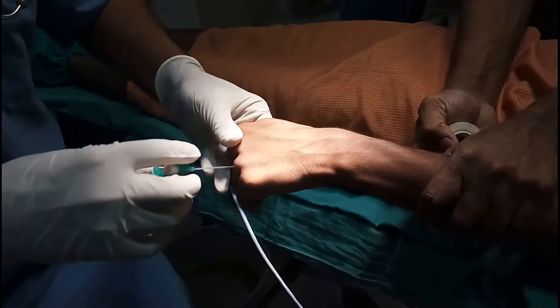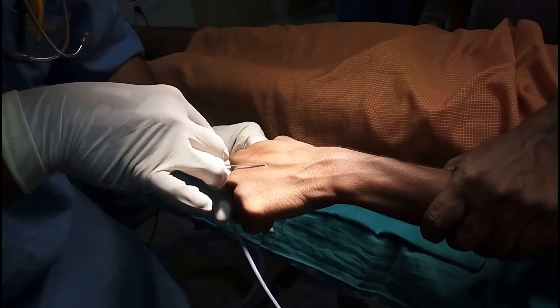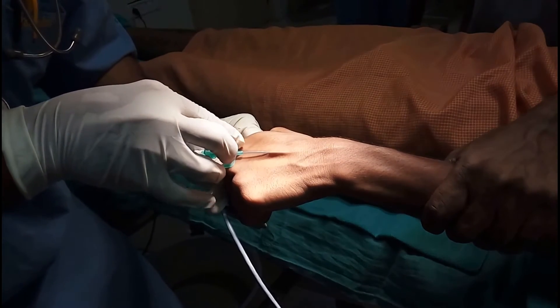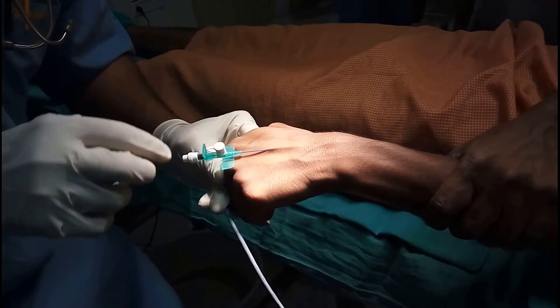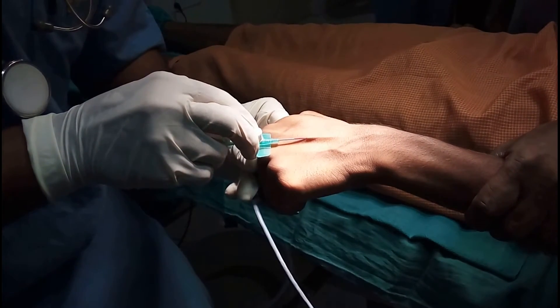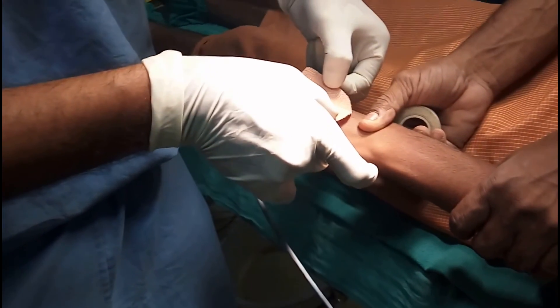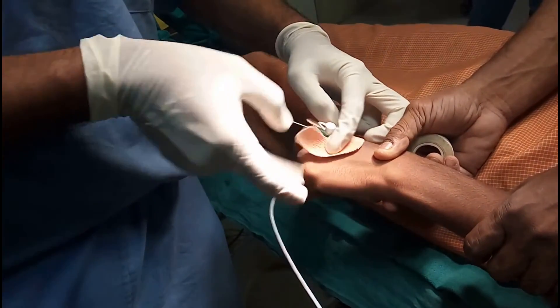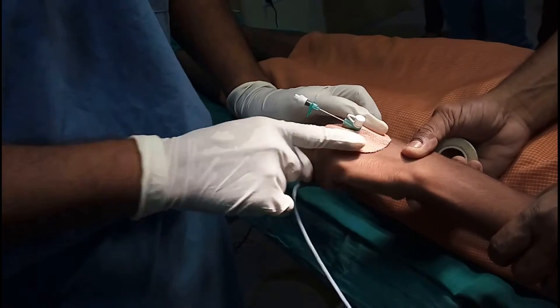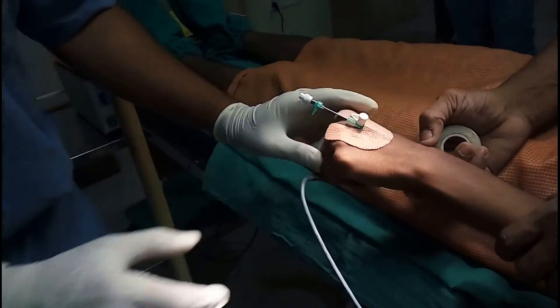Spend as much time as possible on identifying the veins. You will see a backflash of blood in the hub — that's when you dislodge it and then proceed inwards. Fixating the cannula needs an IV fixator. This is not the US FDA approved method of fixating, as it demands a clear fixator that shows what's underneath.